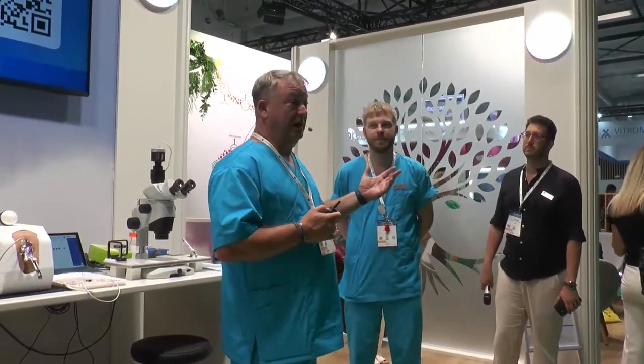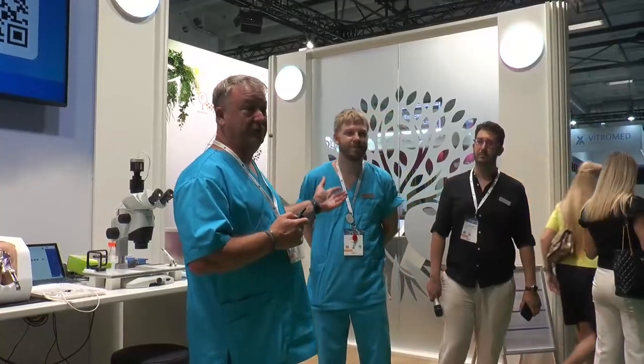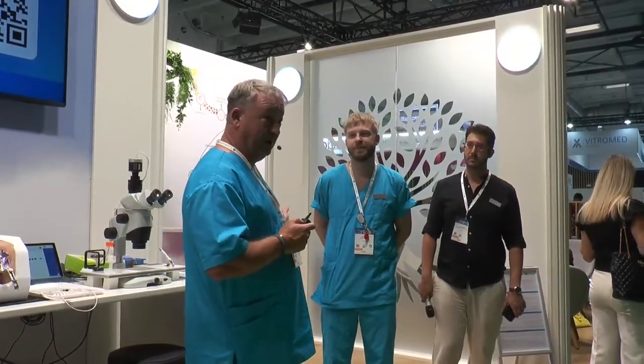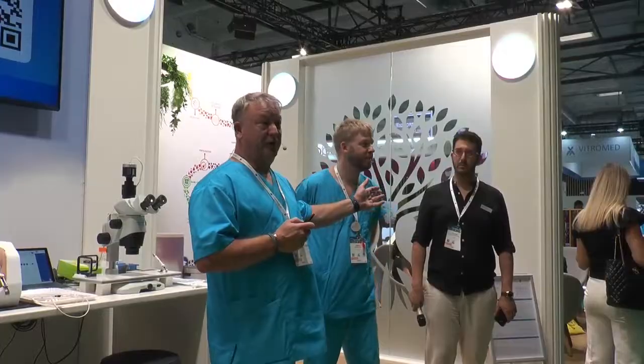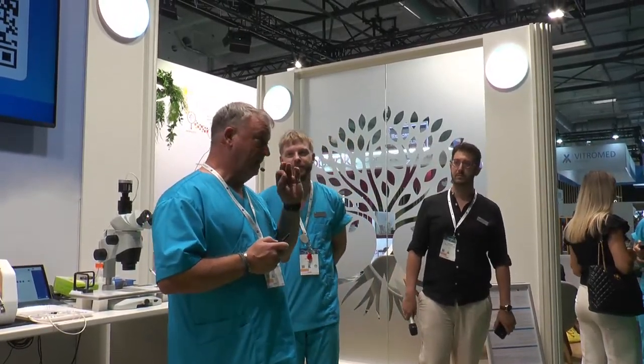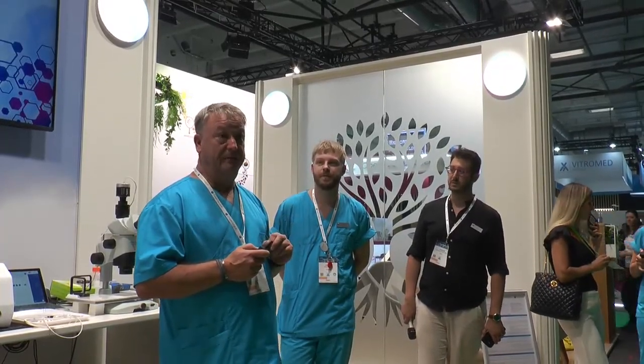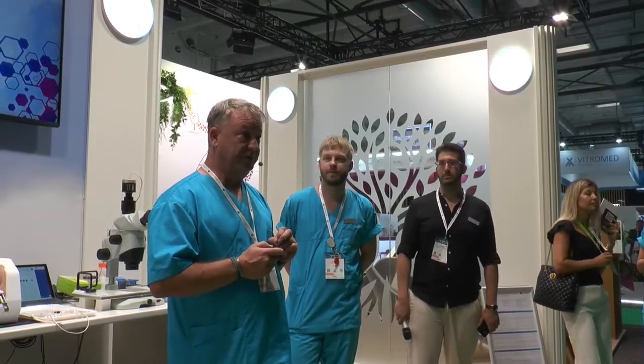I have two esteemed colleagues to help me. I've got Anton Arvidsson to do some of the loading for the embryology part, and I've got my good friend Joaquin Blanco Sanchez, who's going to talk to us a little about the witnessing steps included in embryo transfer and some new technology that Cooper have introduced.